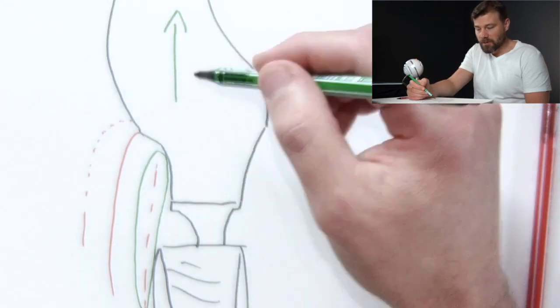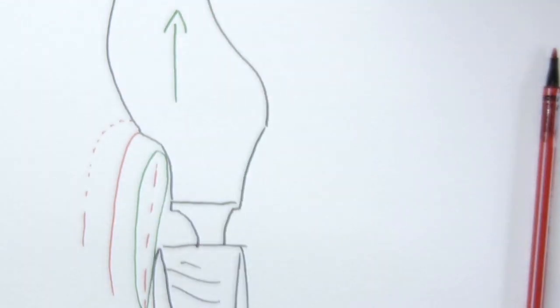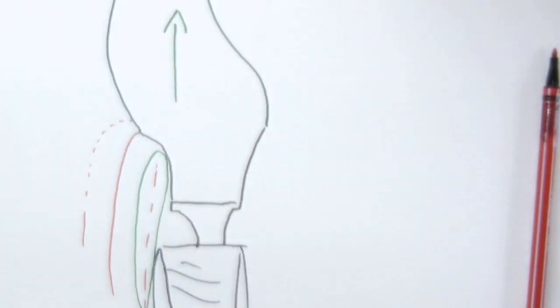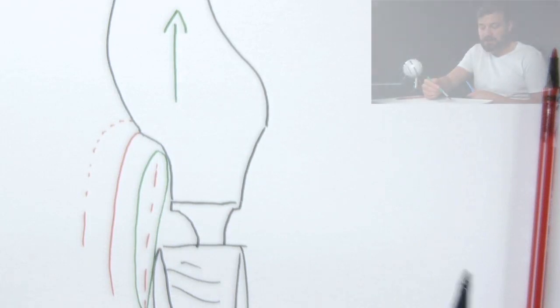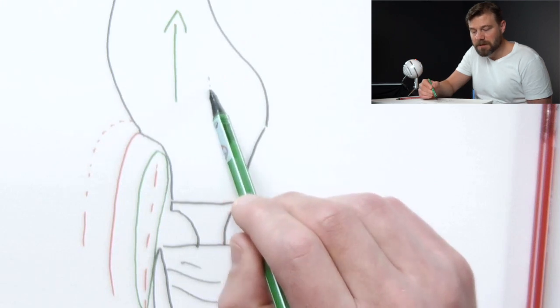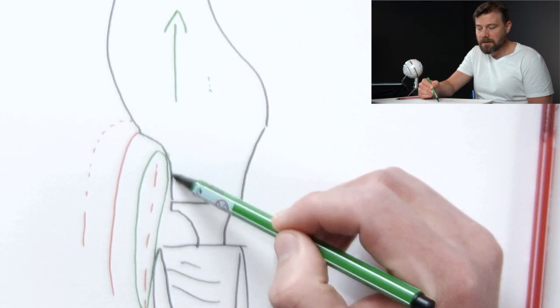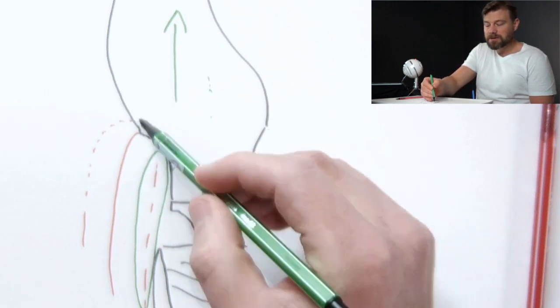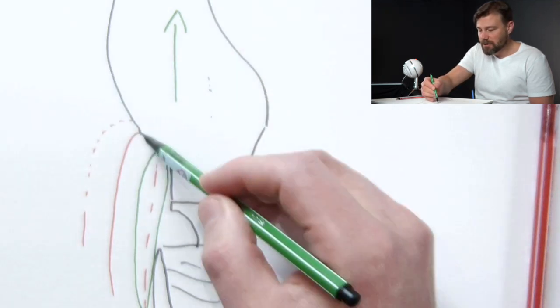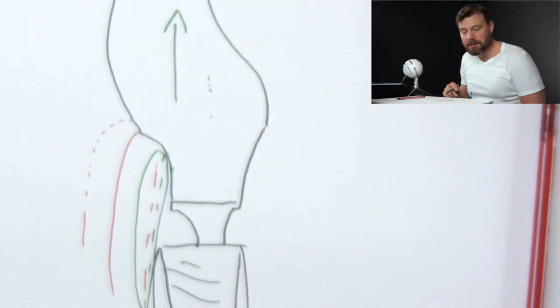If you can remove the crown, this work here is going to be very easy, and you can do that with a lot of safety to prepare this tissue. But if you cannot remove this crown, this difference in the contour of the crown is going to make it very difficult for you to turn the blade and your tunneling instruments to prepare exactly this tissue in the right place.